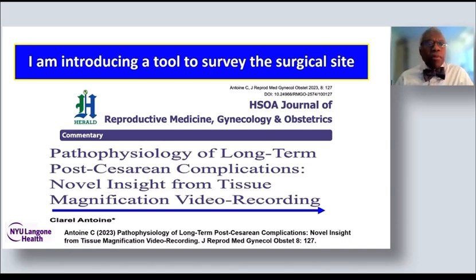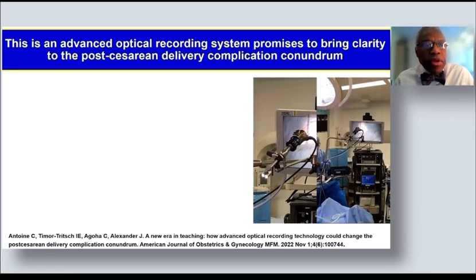I'm introducing a tool to survey the surgical site or the operating field to better understand the pathophysiology of long-term post-cesarean complications, as well as to gain novel insight from tissue magnification and video recording. This is an advanced optical recording system which promises to bring clarity to the post-cesarean delivery complication conundrum.